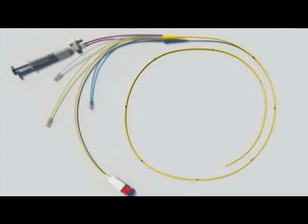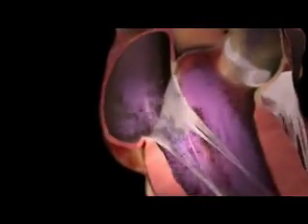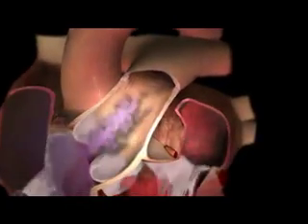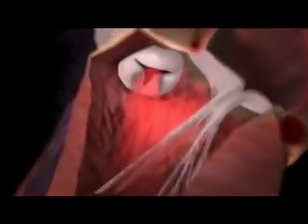The flow-directed balloon-tipped pulmonary artery catheter, also known as the Swan-Ganz catheter, permits measurement of intracardiac filling pressures. The catheter is inserted directly into the right atrium, right ventricle, and the pulmonary artery. The catheter permits measurement of the wedge pressure in the pulmonary artery, which approximates the left atrial pressure. The catheter also permits determination of cardiac output using various techniques.